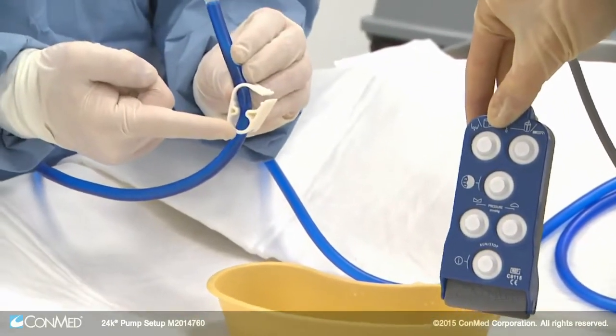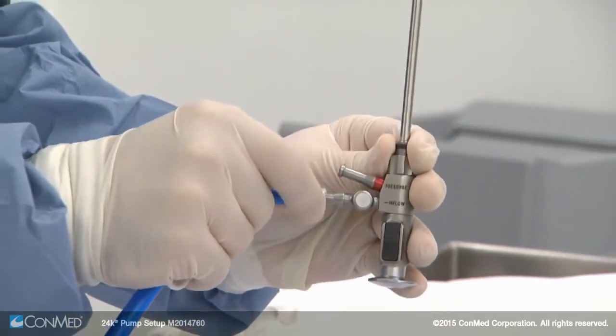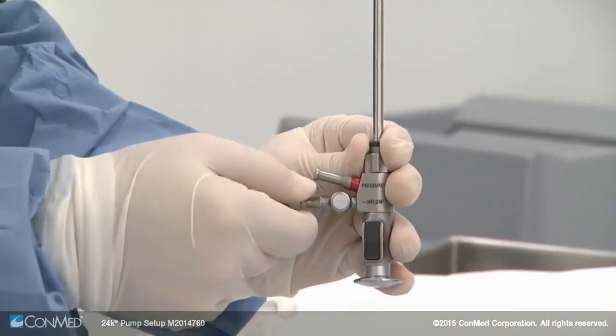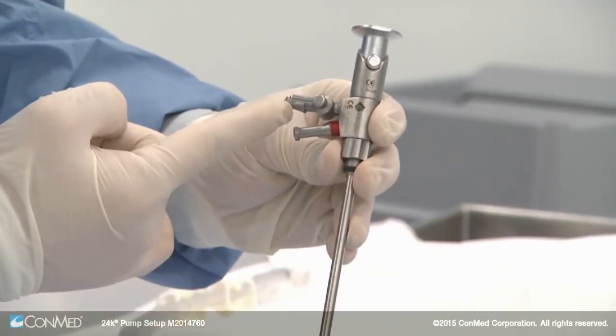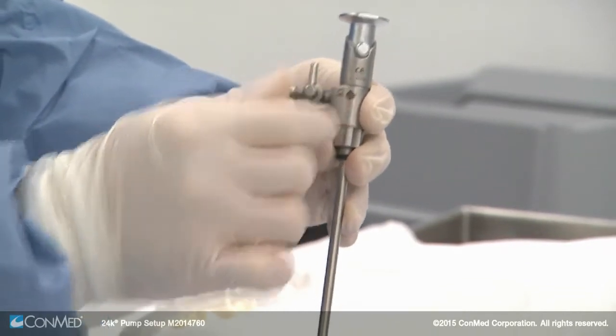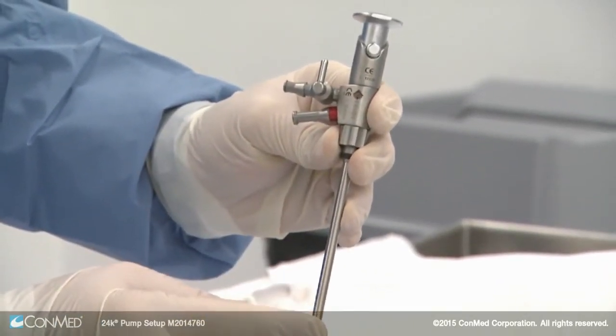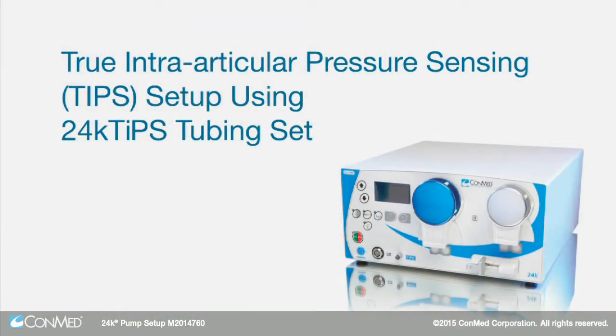Use a single stopcock scope sheath for an inflow-only case. Attach the inflow line to the inflow port with a twisting motion until snug. On the reverse side of the scope sheath is the on/off inflow lever. When the lever is aligned with the inflow port, inflow is open; when not aligned, it's closed.